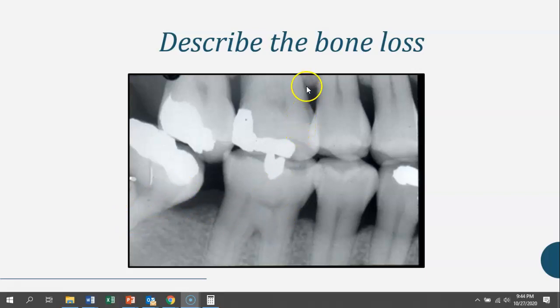This is an area where it's affecting the periodontium because of where the tooth is placed. But if you look at these other areas, through here, through here, through here, how much bone do you think has been lost for this person? Do you think it's less than 15% or somewhere between 15 to 33%? If you said more than 15%, that's where I'm at too. I'm thinking they're closer to a stage two with horizontal bone loss.